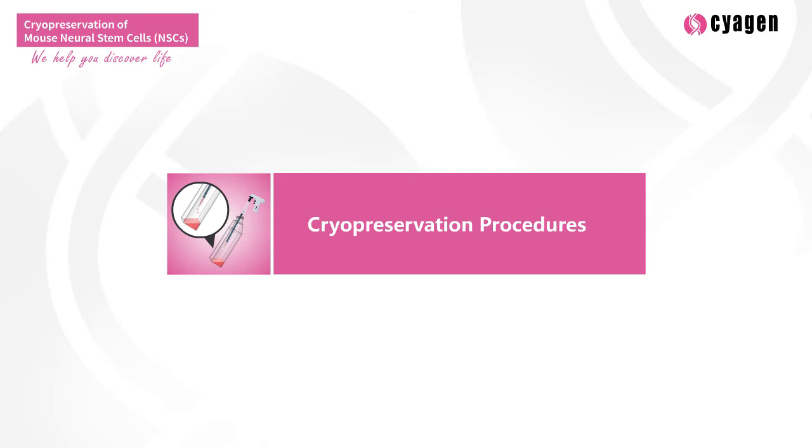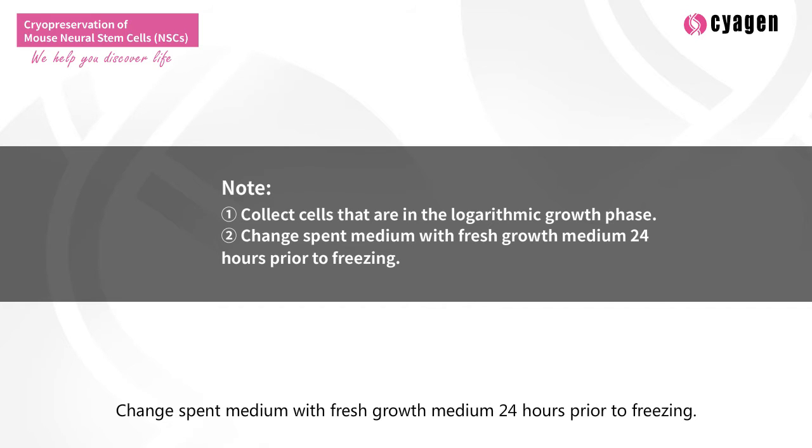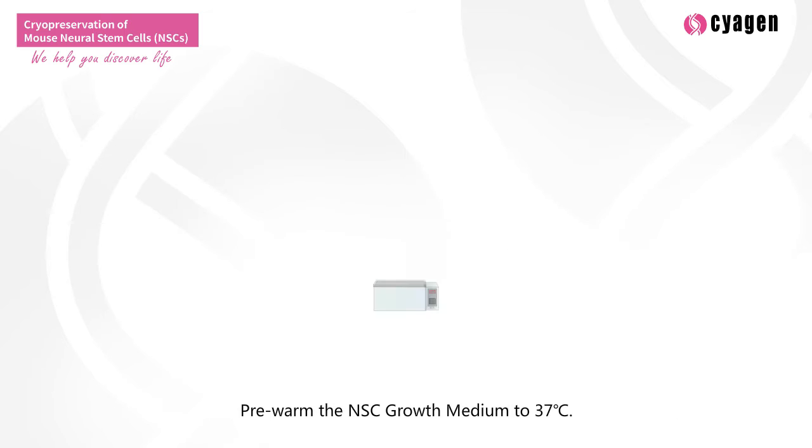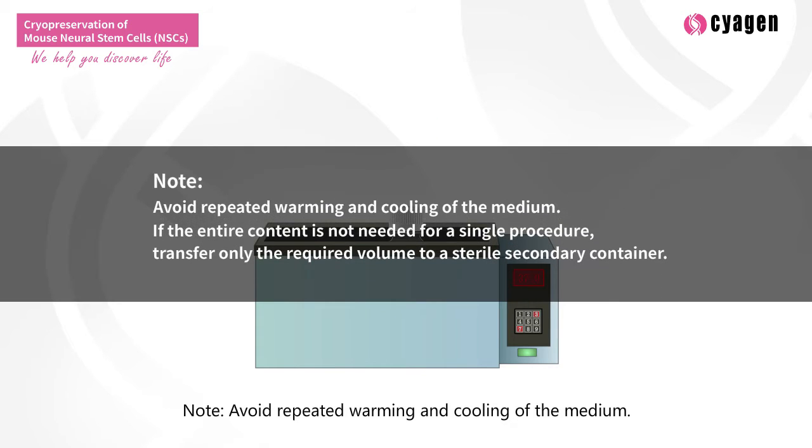Cryopreservation procedures. Note: collect cells that are in the logarithmic growth phase. Change spent medium with fresh growth medium 24 hours prior to freezing. Pre-warm the NSC growth medium to 37 degrees Celsius. Note: avoid repeated warming and cooling of the medium.